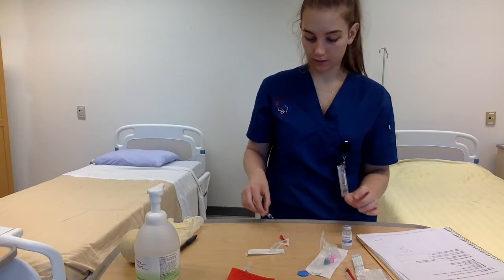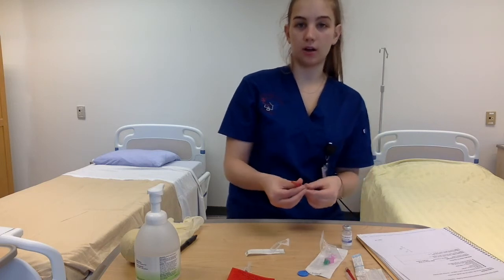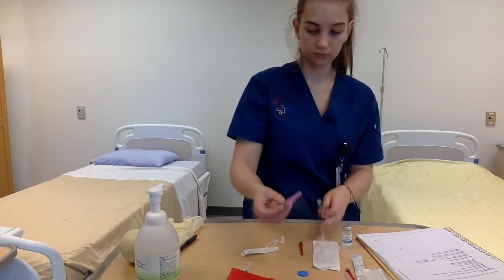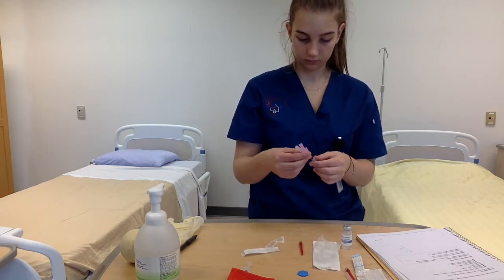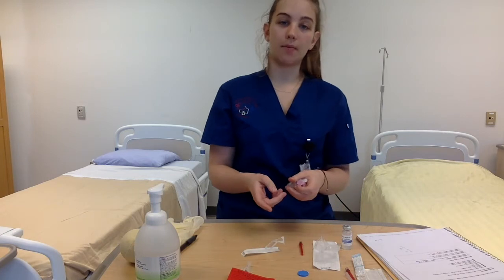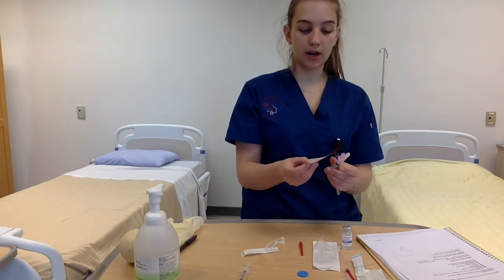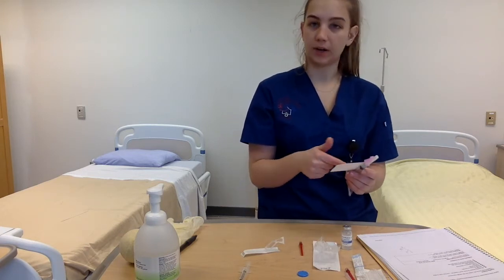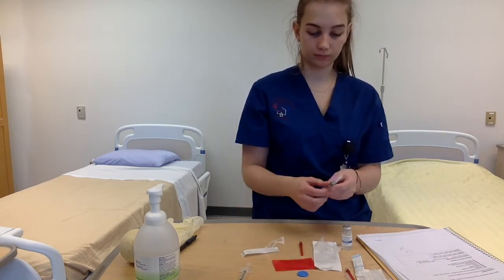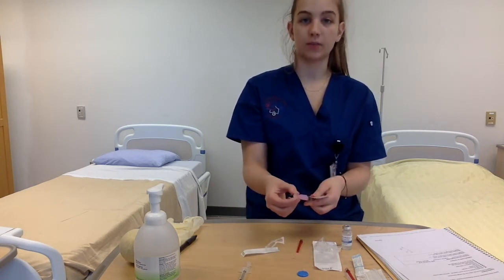And then I'm going to carefully put the cap back on to switch the needle to have it be the appropriate needle for this injection. And again, I'm going to grab a medication label that I have right here, and I'm going to put all the patient's information on it and say which medication this is, so that I won't get it confused with my other injection that I'm doing. Okay, I'll attach that, and then I can remove the cap once I'm ready to give the injection.